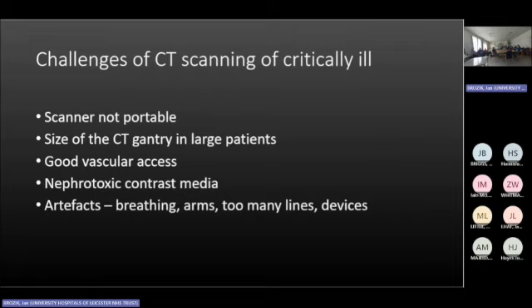Vascular access, ideally a green cannula in the arm. I know that not every patient can have that, and our radiographers often ask for a cannula even if they have a central line. Can you guarantee us that line will take the pressure of the pump?